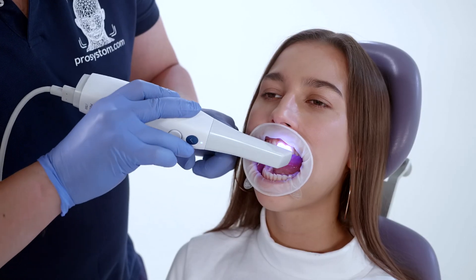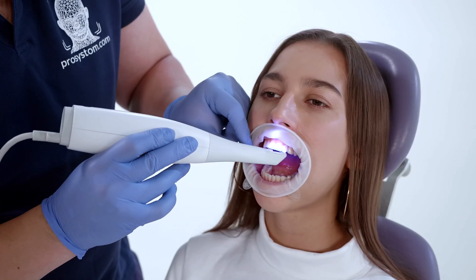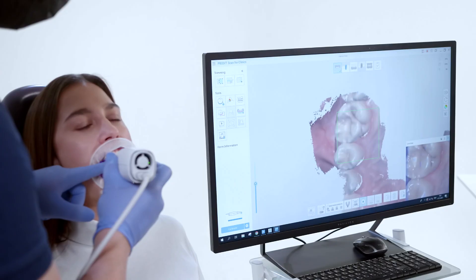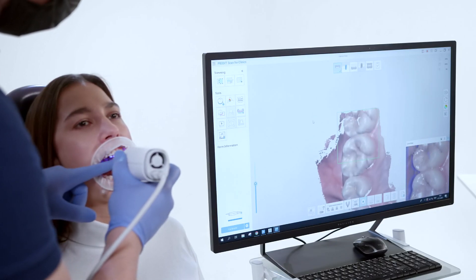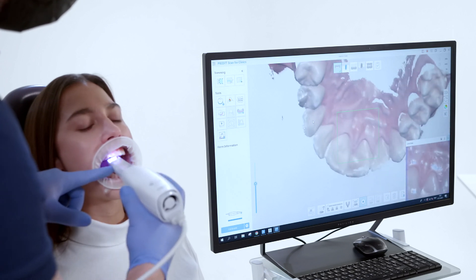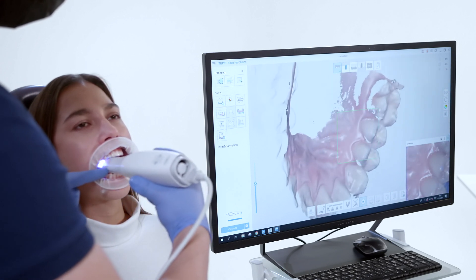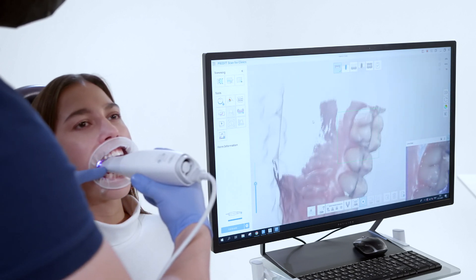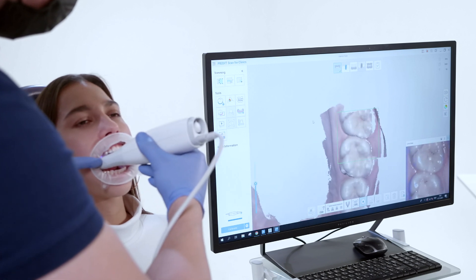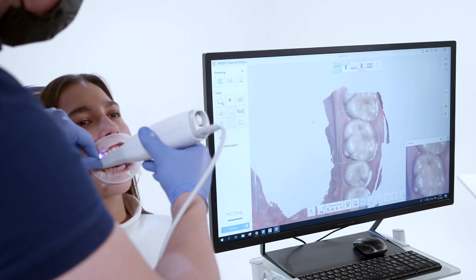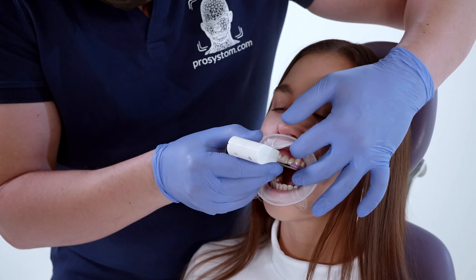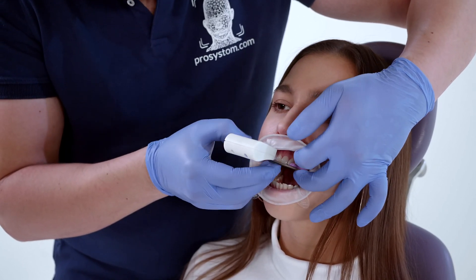It is possible to use any scanner to scan the dentitions. Next, we position the bite fork with the register in the oral cavity and continue scanning.